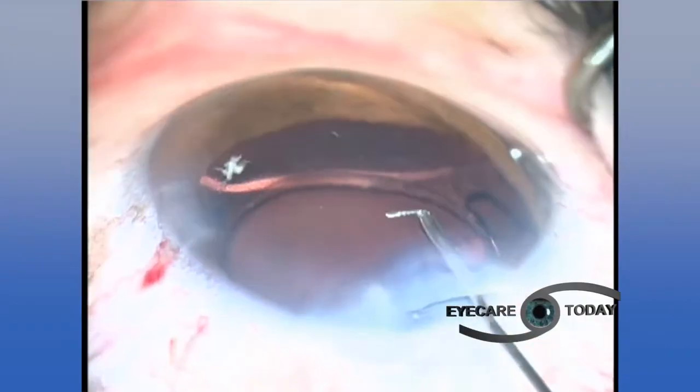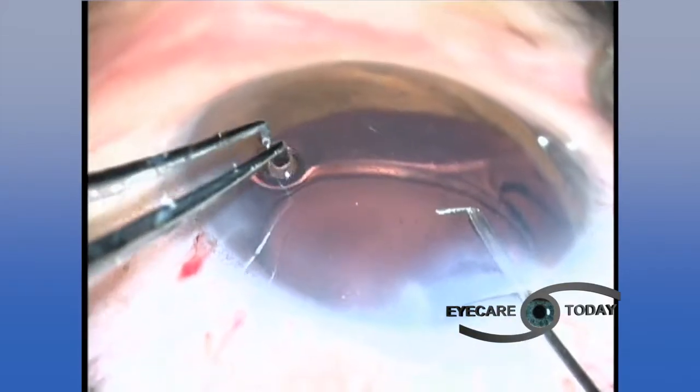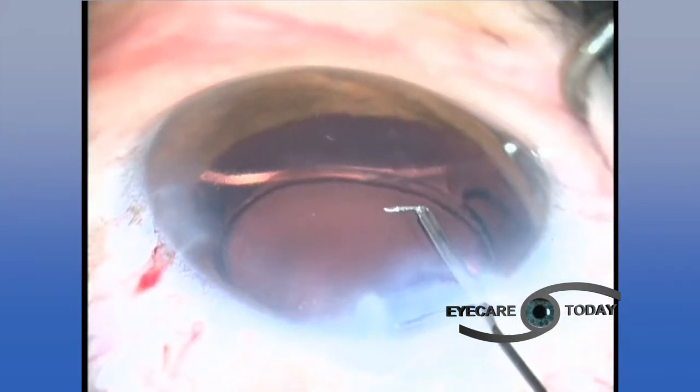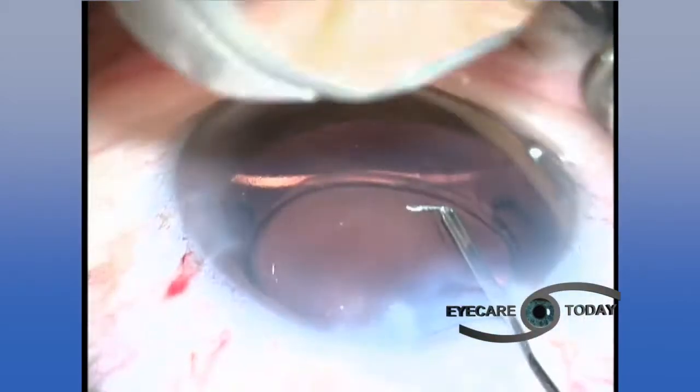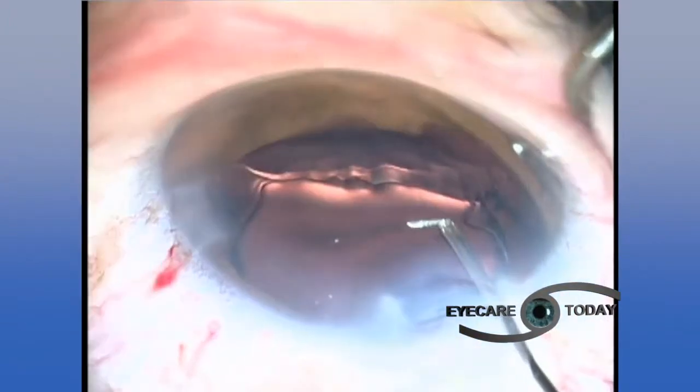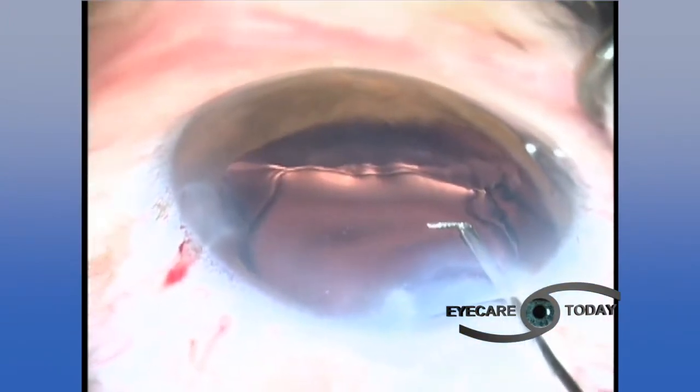Right. Okay, so now you can actually see the stent, and you see the implant from the completion of the cataract surgery. We're going over the top of the implant, and you can see a nice glistening little iStent right there. And now I'm going to be putting on that special mirror, and there's a lubrication between the mirror and the top of the eye here, the cornea.